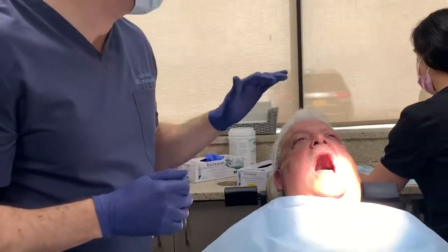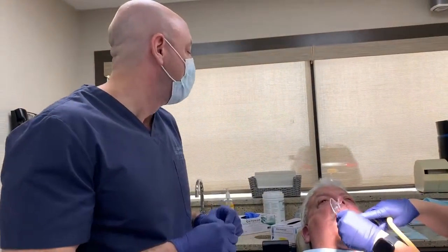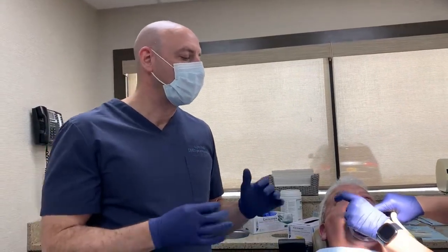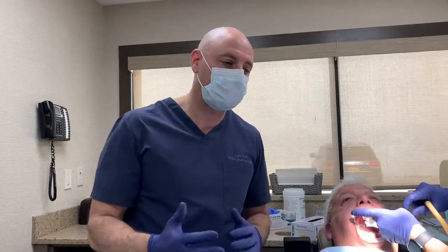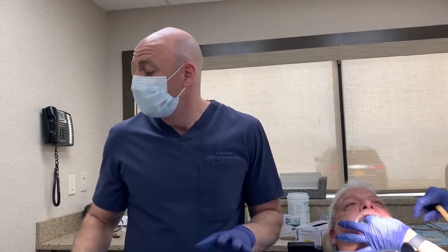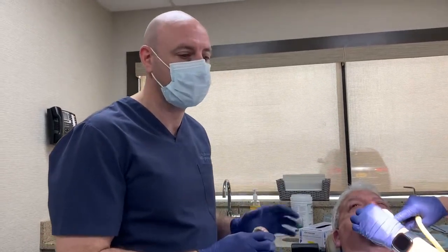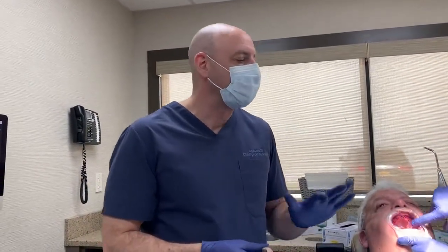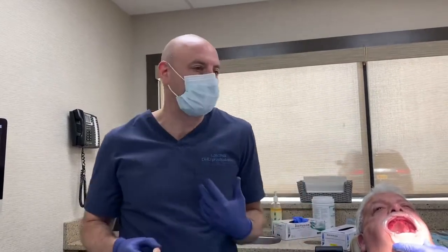I will have the interim prosthesis cleaned, preserve every screw, and we will give it to the patient. Tell the patient to keep it in a safe place, in a safe or safety deposit box, because if they have to have the definitive prosthesis serviced for whatever reason, it fractures, it breaks, they fall, there's an accident, at least we have a backup. And I like to have the patient carry it so I'm not responsible for it.